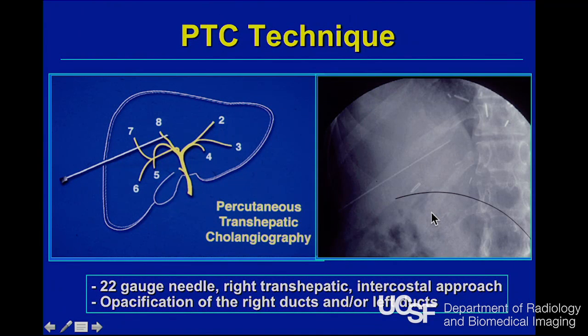So how is PTC performed? Fine needle cholangiography is the typical approach nowadays. The 22 gauge needle is adequate under fluoroscopic guidance, plus or minus ultrasound, depending on operator preference. Generally speaking, I use ultrasound for left-sided approach, or on the right side when there is biliary ductal dilatation. If there is no biliary ductal dilatation, for instance, for cases with biliary leaks, I use fluoro only.